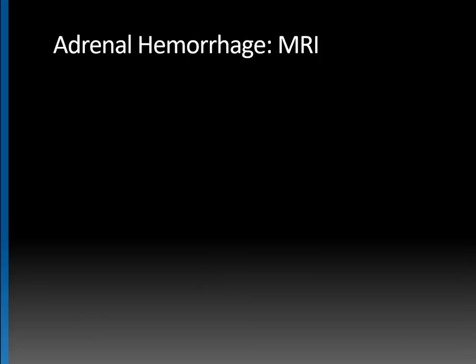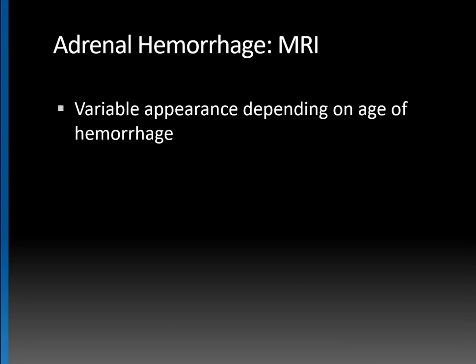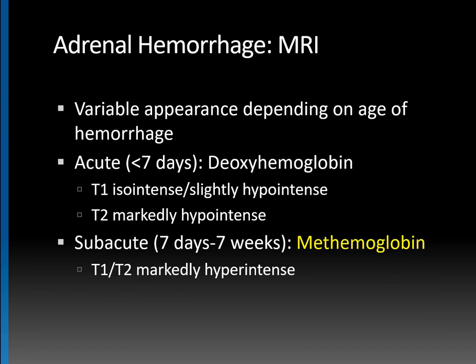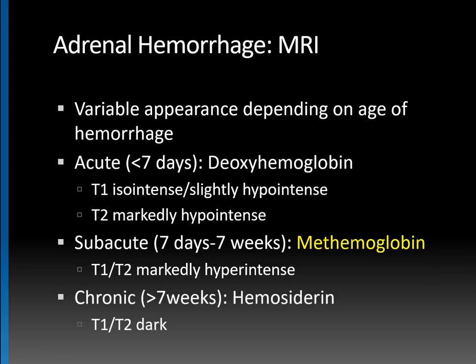Adrenal hemorrhage on MRI has a variable appearance depending on the age of the hemorrhage. With acute hemorrhage, defined as less than seven days, you have predominantly deoxyhemoglobin, and the mass will be T1 isointense to slightly hypointense and T2 markedly hypointense — fairly dark on both sequences. With subacute hemorrhage, defined as seven days to seven weeks, you have predominantly methemoglobin, and the mass will be markedly hyperintense on both T1 and T2 — that's what we have in this case. With chronic hemorrhage, more than seven weeks, you have mostly hemosiderin, which is dark on T1 and T2. In real life, you often get a mix of different signal intensities, especially if there's ongoing bleeding or re-bleeding.